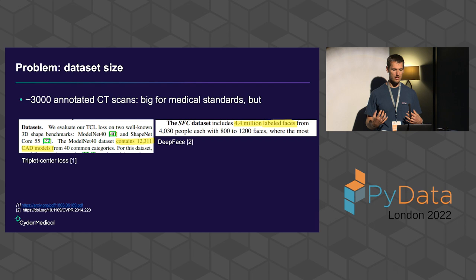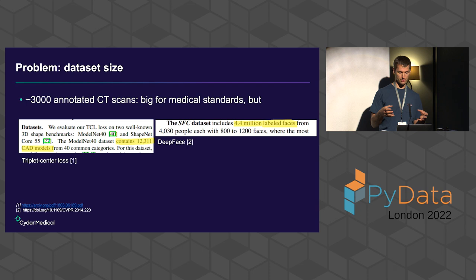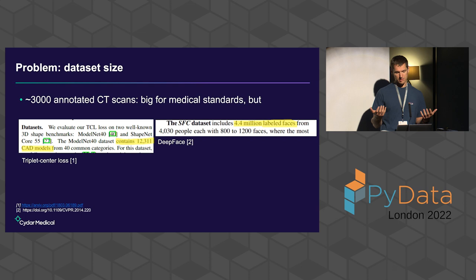on the aorta. And the papers that I've cited there, and I mentioned the other approaches to finding similarity, use either a million 2D images, like similar faces, or thousands of CAD models from which they can create projections and generate the similar or dissimilar data. So we decided that we'll use more of our in-house domain knowledge to represent the anatomy in a way that's comparable. And also a good side effect would be if it's interpretable, because in the end we're going to show it to clinicians, and it's a feature if the black box that they're given gives outputs which are interpretable.